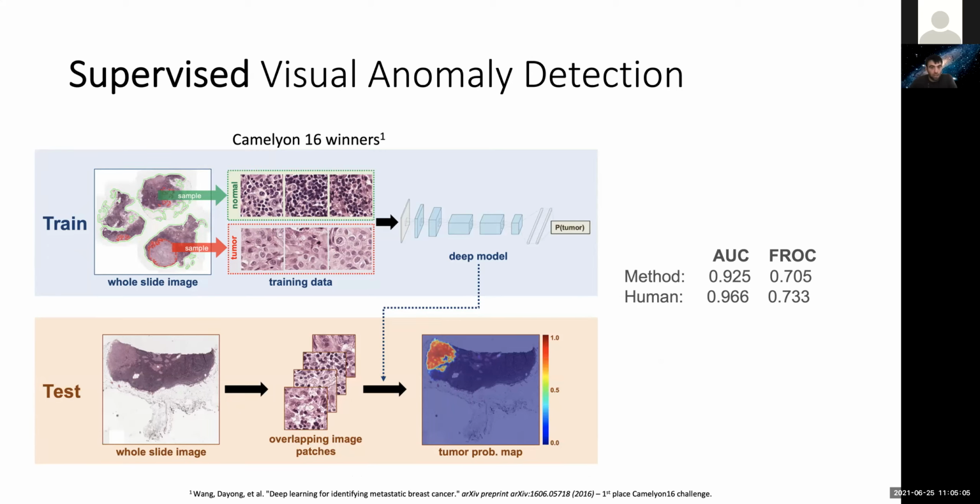In this competition data, the method achieved pathologist-level performance on both slide as well as lesion level detection tasks, and those results were further improved in later works. The real problem lies in obtaining labeled data, which is especially difficult for such biomedical applications, where only trained domain experts can provide such labels. And the data itself is usually also of high complexity in terms of representation as well as dimensionality.